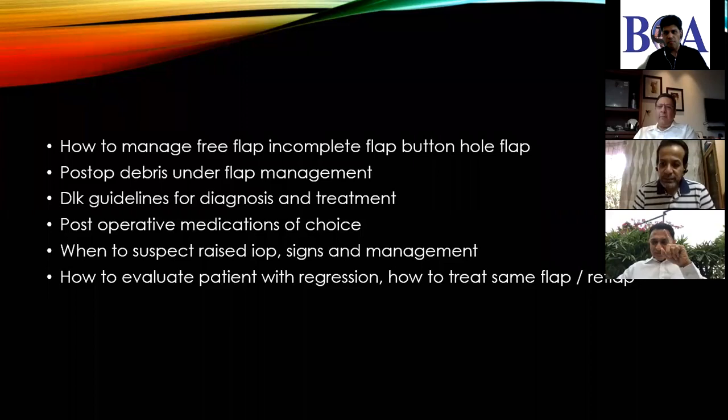Himanshu, anything? Bajar, go ahead. Also be well aware, once you've made that ridge in the conjunctiva and sclera with your suction, and you've then, for whatever reason, stopped the suction and put the ring back on again, the eye will go right back into that groove.